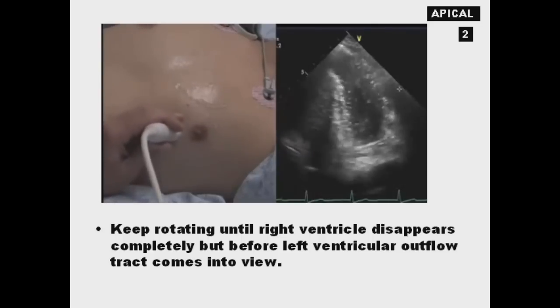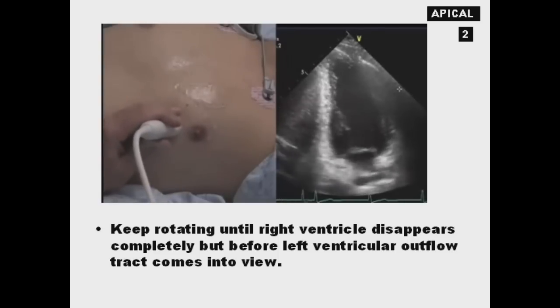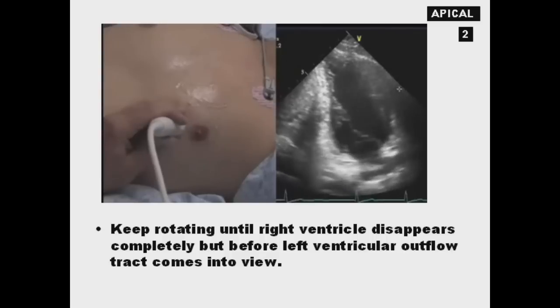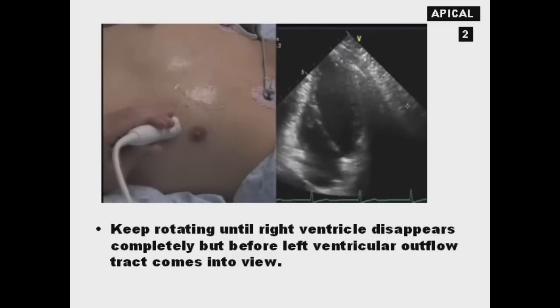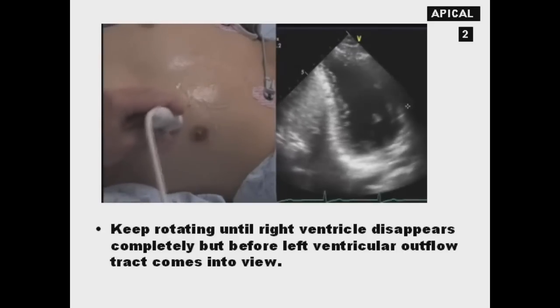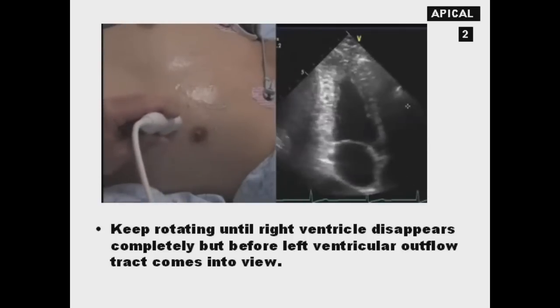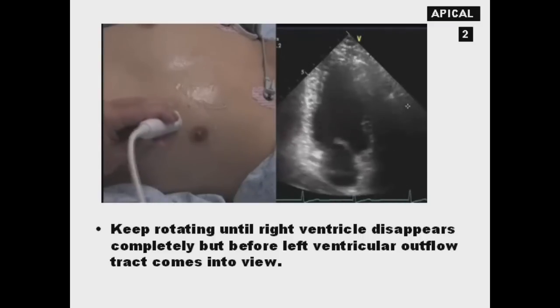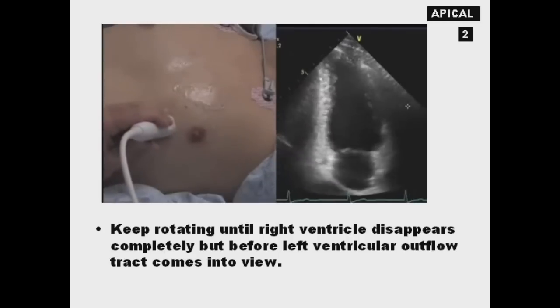So by doing a circle survey, I may be able to stumble into a nicer view of that anterior wall. Now look at my hand. If you notice, the heart is pointing off to the side. If I adjust my transducer parallel to the beam coming out, or the wedge coming out of my probe, you can see how that affects the transducer moving across the screen. So in this case, I'm going to need to move down a little bit the tail of the transducer to make my ventricle more vertical on the screen.